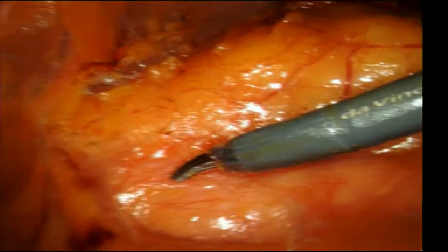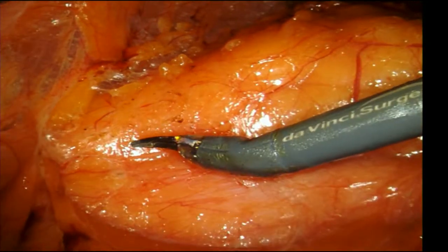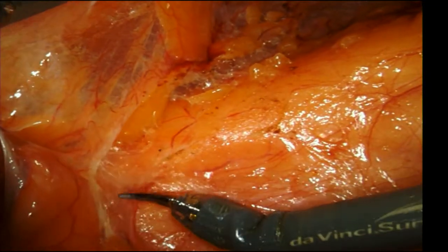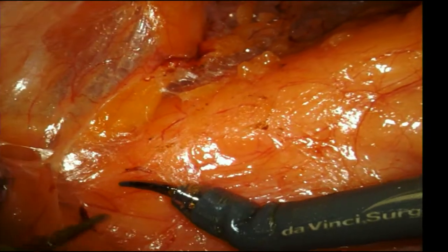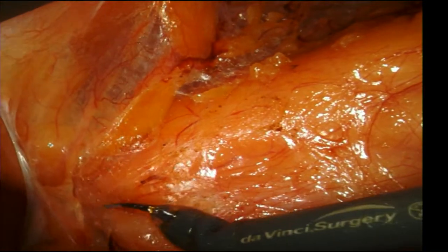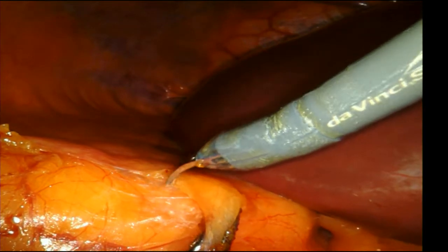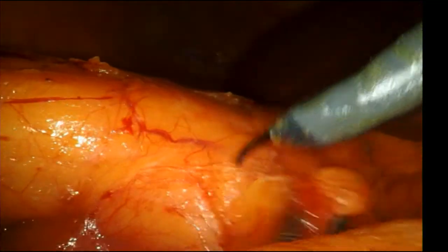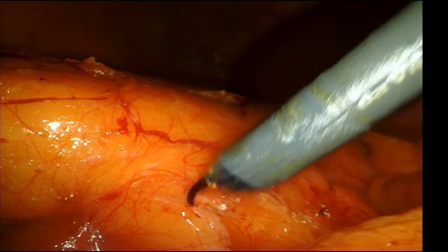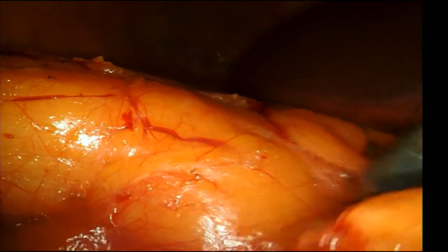Ronnie, it's Jay here. Do you do any preoperative renal scans for function, on select patients or all patients? What are your thoughts on that? Yeah, I don't routinely, honestly. The only time I would is if I had a patient who was really on the borderline of nephrectomy versus partial, and I wanted to know, how essential is it that we do a partial on this patient? For example, if you have a patient with a really large mass, normal contralateral kidney, and you're thinking, this is an 8-centimeter mass or something. It's feasible to do a partial, but should I really do it? Then I might do a renal scan, and if the renal scan is showing 50-50 function, then I might be more likely to do a nephrectomy. Whereas if it's showing the patient actually needs that kidney, then I would go for a partial. But I don't routinely do it.